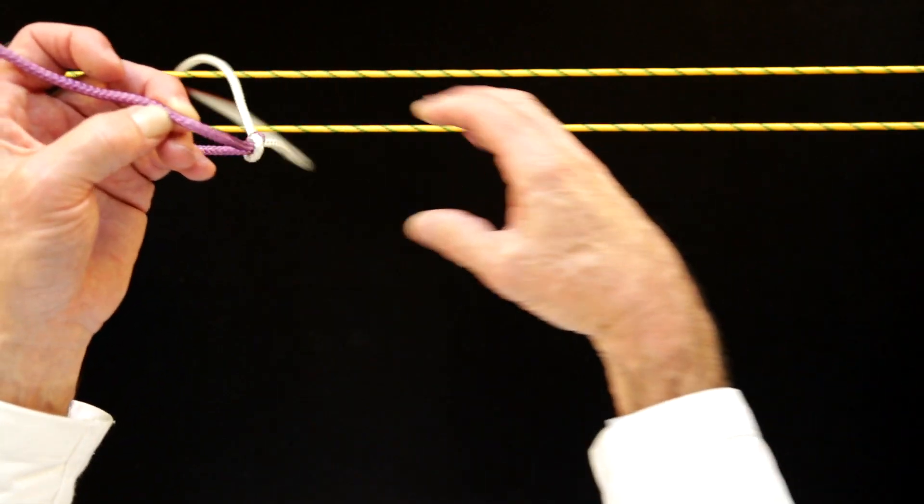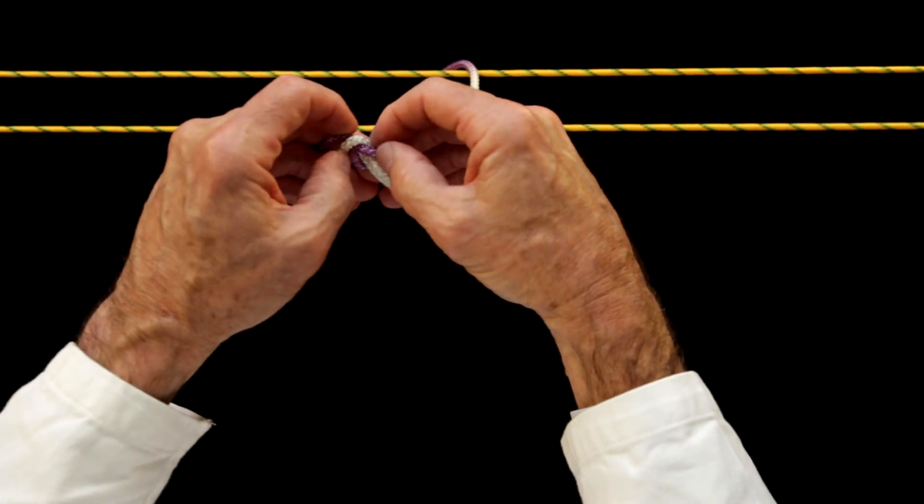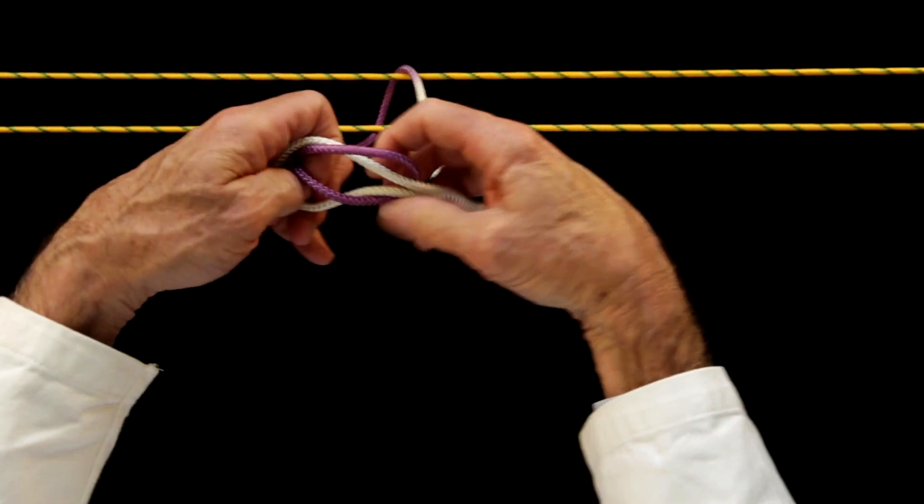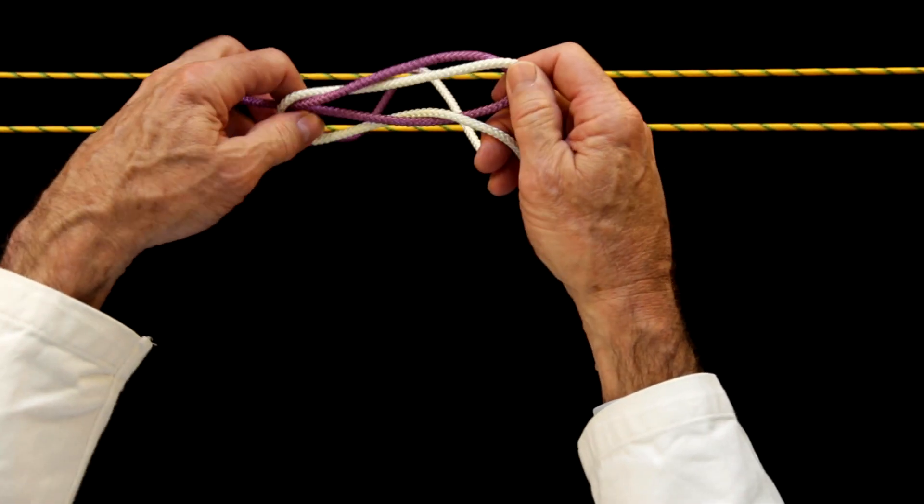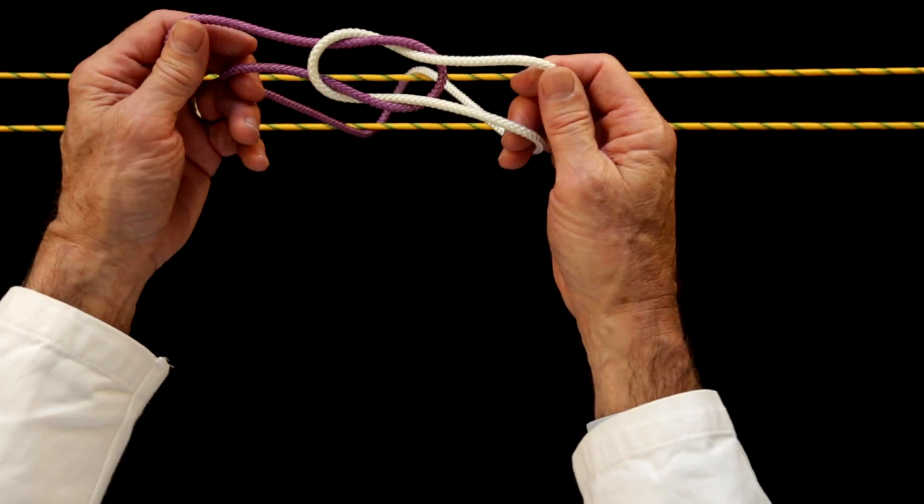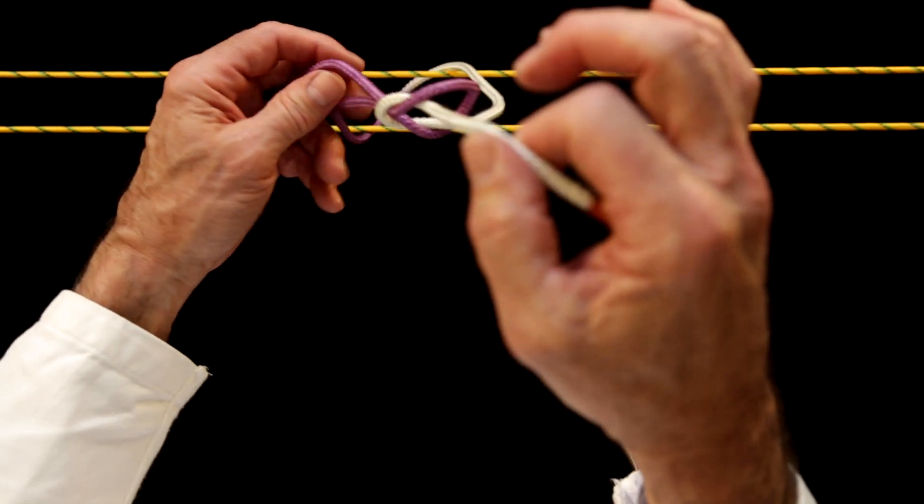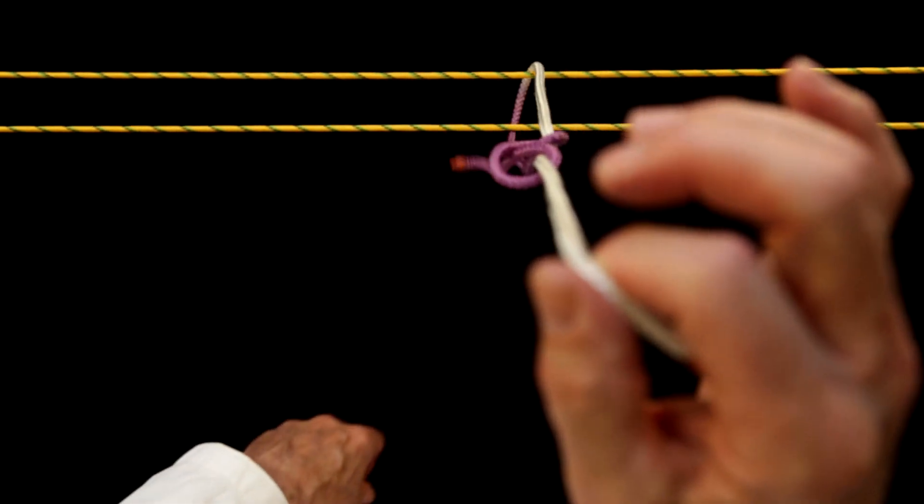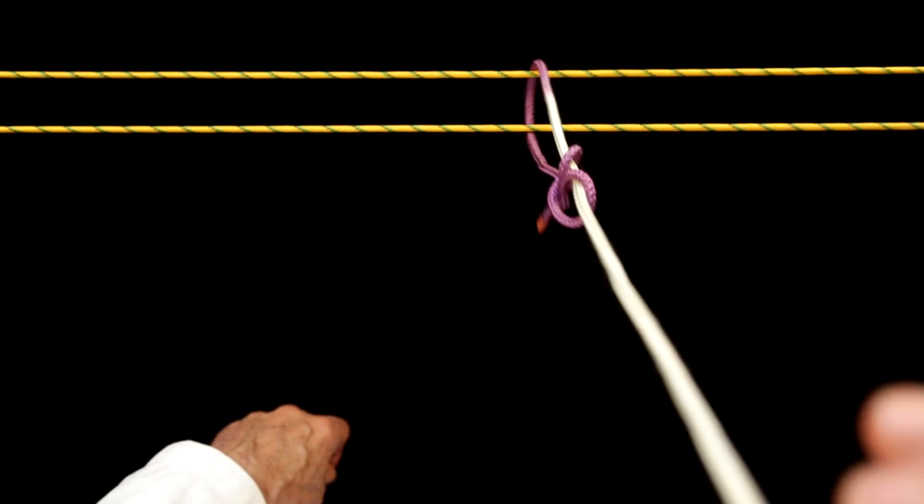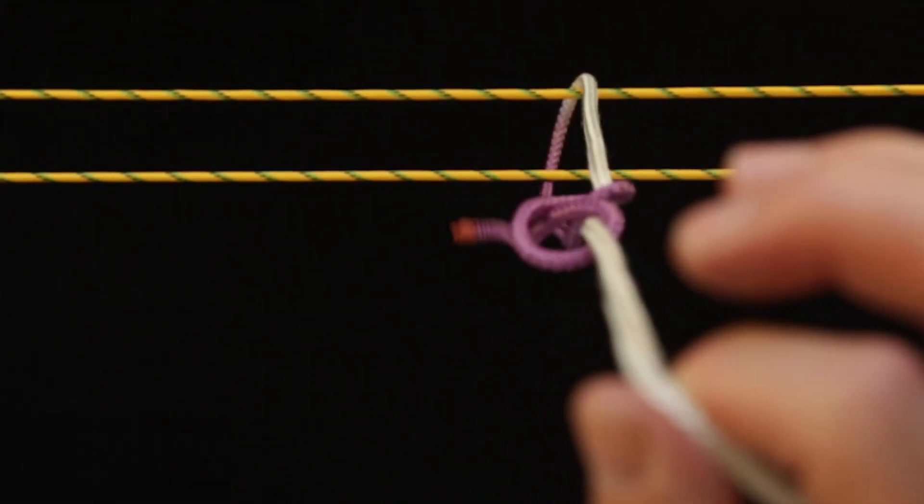Notice also if we take this knot apart, loosen it up again, what happens if you don't put tension on both working ends. If you put tension on only one working end, the knot changes configuration and slides. This is an important point we'll return to later.